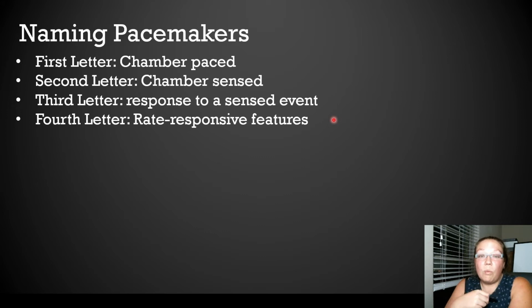So when you go for that walk and you have a pacemaker, the pacemaker will pick up on the signs that we're about to go for a walk, that we are walking, that we are exercising, and it'll increase that rate automatically because it is responsive to your body. That to me is just so cool. No longer are these people having to stay out of activities that they would normally do if they had a healthy heart. Now they can go out and do everything that they would normally because their pacemaker is able to respond. That's just so neat to me.